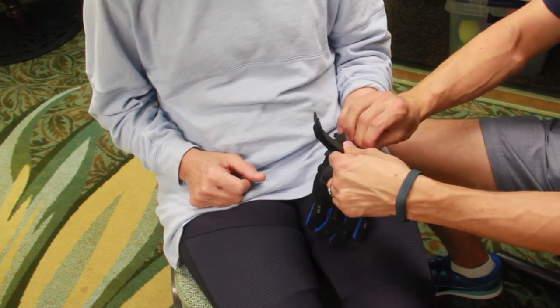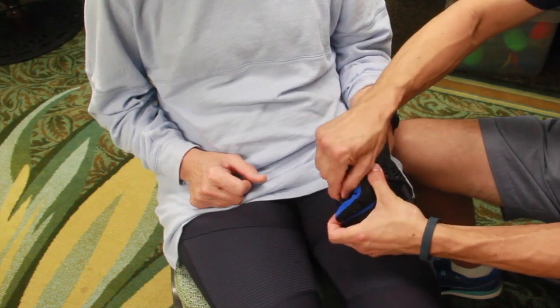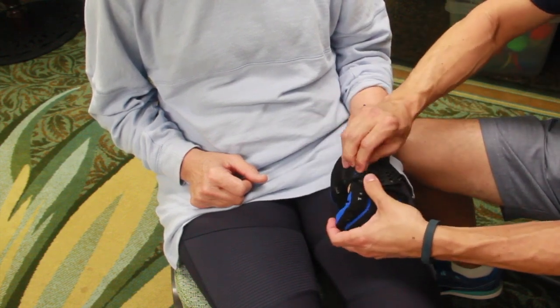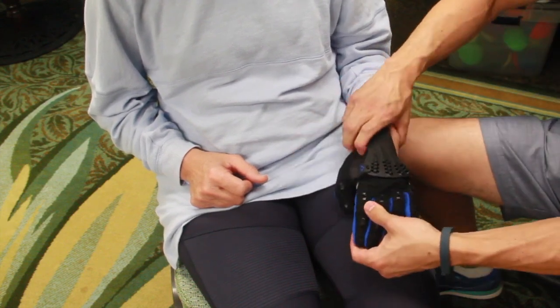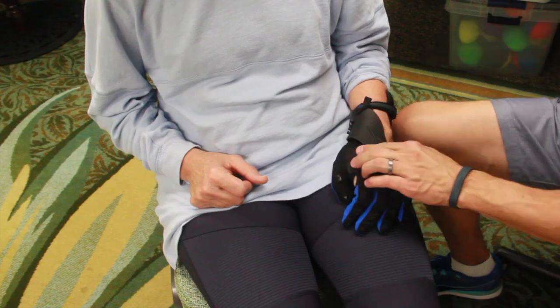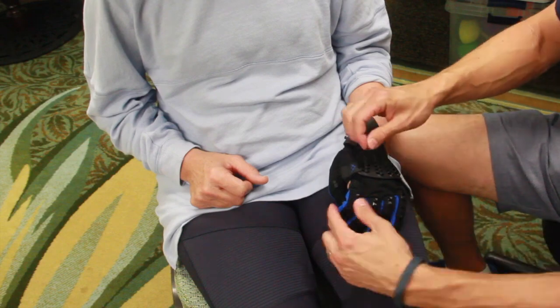And then you can apply the hand strap. You can adjust that hand strap as well, just like we did the forearm strap, and then connect it to the hand portion of the splint. At that stage, you are done with the straps, and it's now time for the tensioners. So step 2 is applying the tensioners to give you the finger and thumb extension assistance that you need.